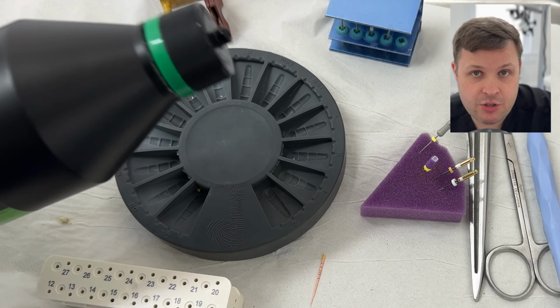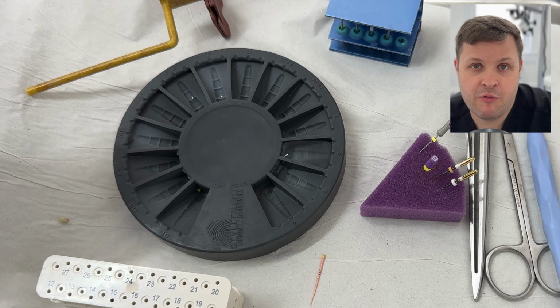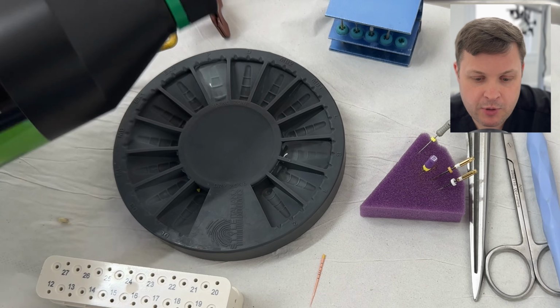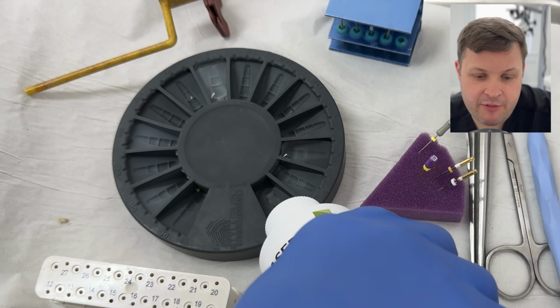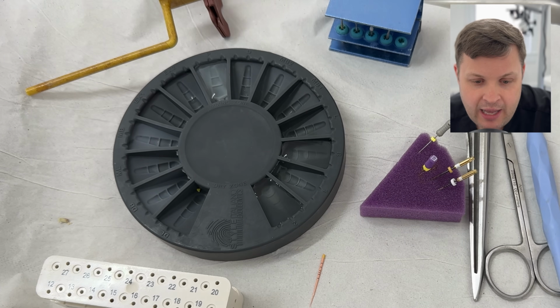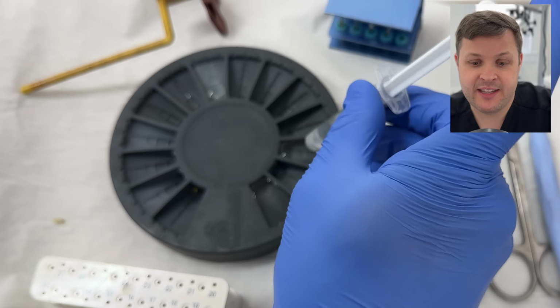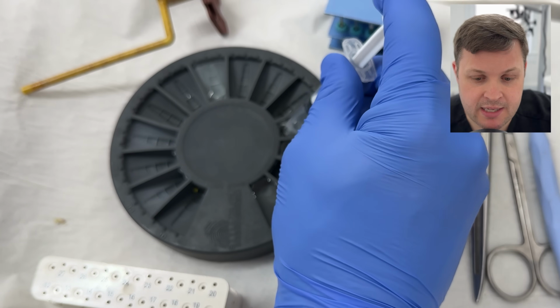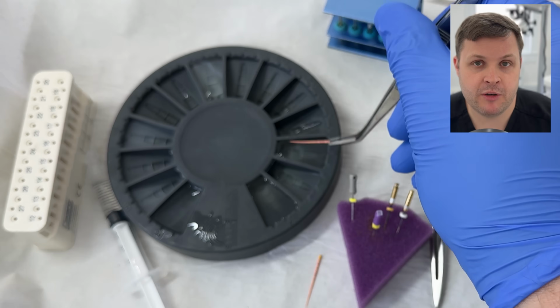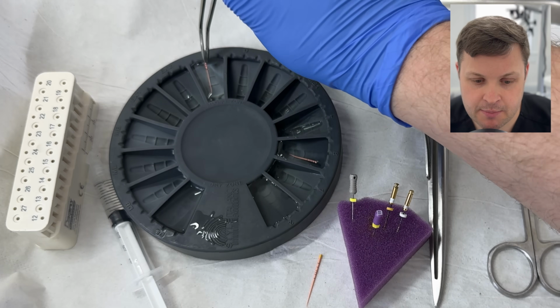Whilst the X-ray is developing, however, I'm going to prepare ourselves ready for the obturation. So I'm going to fill these wells with sodium hypochlorite, and then I'm going to use a different well to fill this with EDTA. And then I'm going to place some isopropyl alcohol. And the reason why we use this will become apparent later on. And then I'm just going to remove the GPs from the canal space, and then we're going to dip these and disinfect these into the bleach.